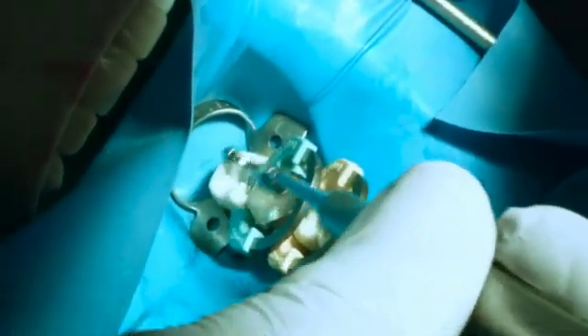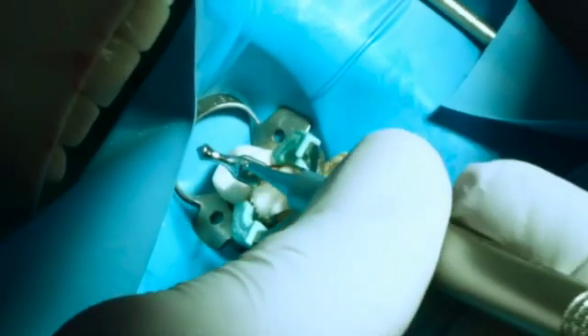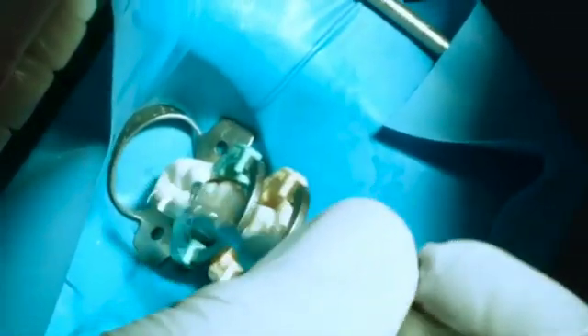I'm not concerned about carving this — I'm going to go to the hard state. I will use the other end of it to do a little bit of a starting point with that acorn. Then I hit it with the light and harden it to the maximum.